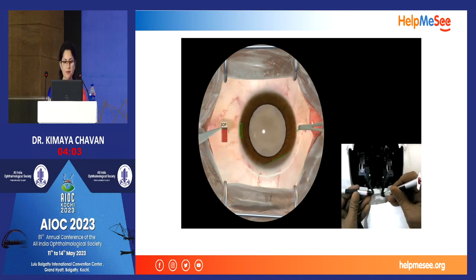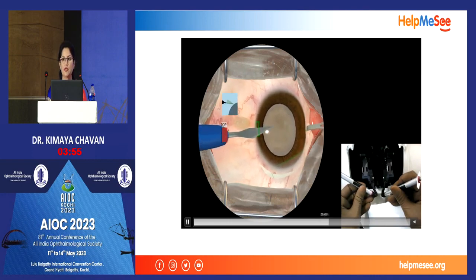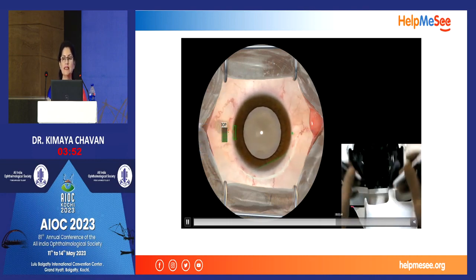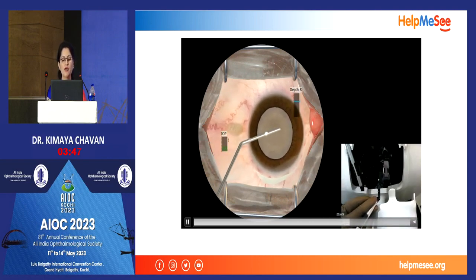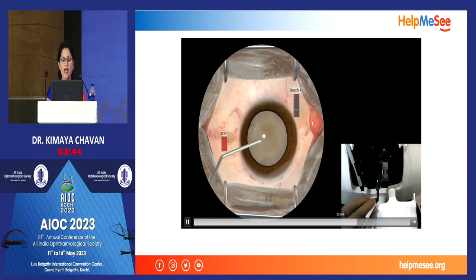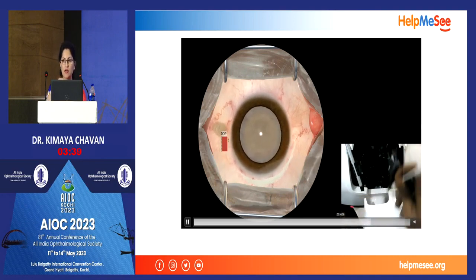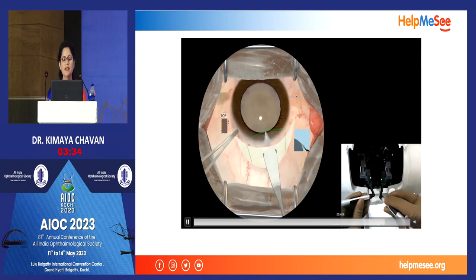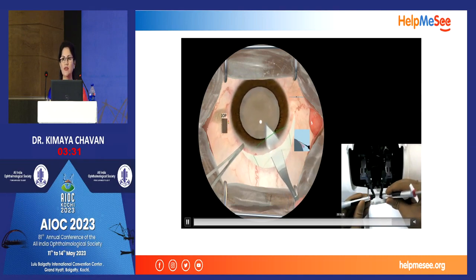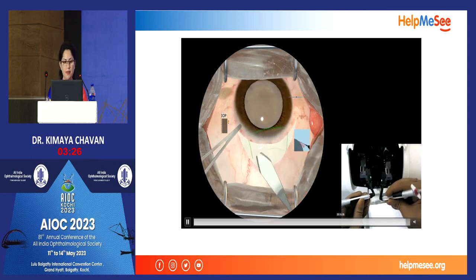Now I have chosen paracentesis. I have chosen a 15 degree blade, and I'm going through. You can feel the same resistance of the cornea. Now I'm going ahead with the viscoelastic injection. You can feel the tension within the anterior chamber when you inject the visco. It is unbelievable, but it's very true. You can feel it on the cornea. Here you can see the surgeon going like this and then tilting his hand, and only then can he enter, as we teach in normal surgery. Every step like this you can teach the students.